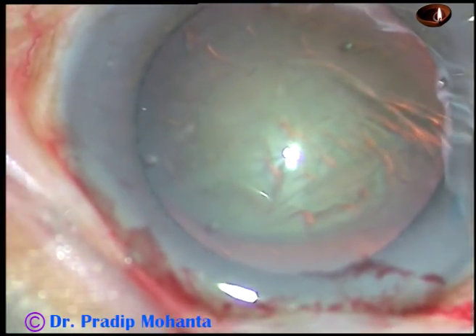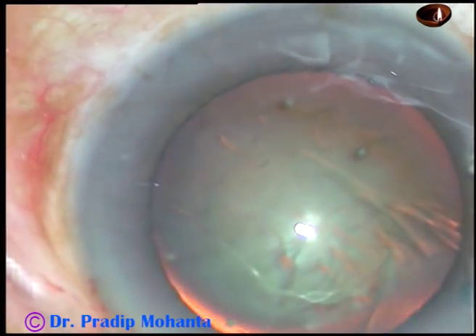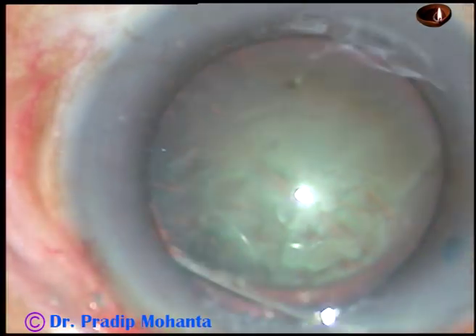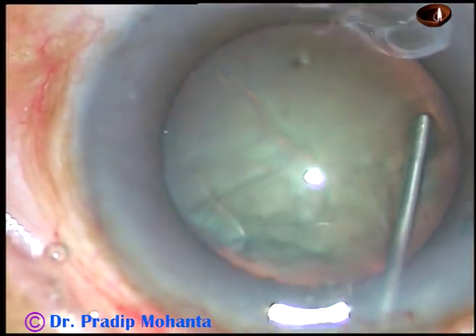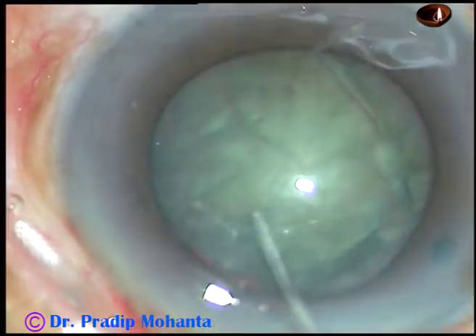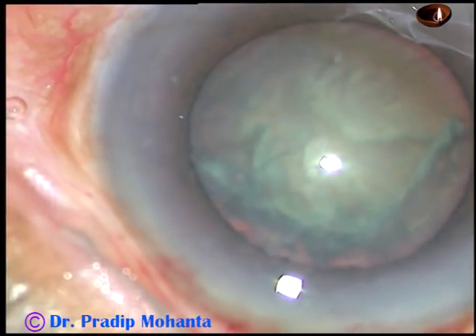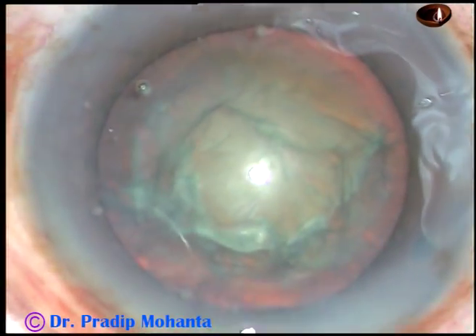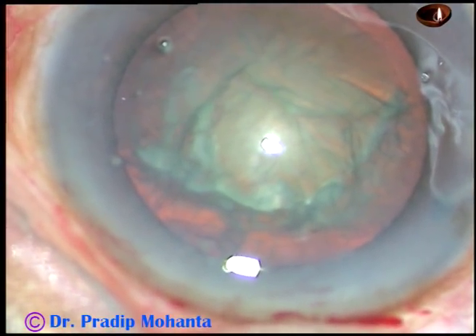Because the anterior chamber was very shallow in this case. Now, hydrodissection with a 27-gauge cannula attached to a 2 cc syringe with BSS. The fluid wave goes to the opposite equator. The nucleus is tapped and rotated. And now, 2% HPMC is injected again. In this case, I will not clean the superficial cortical matter because the anterior chamber is very shallow.